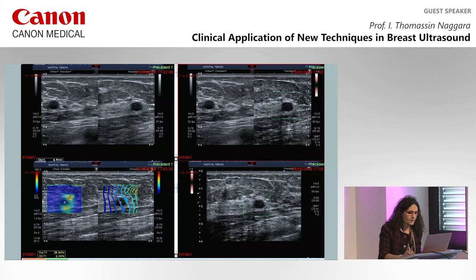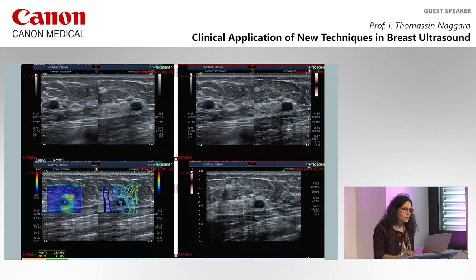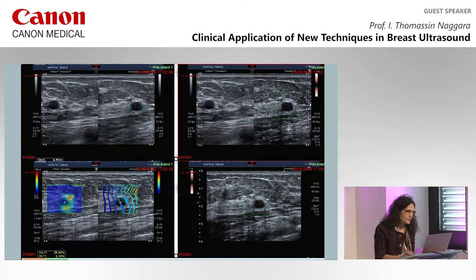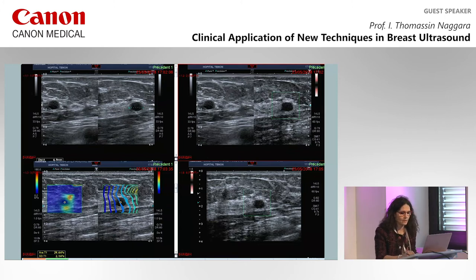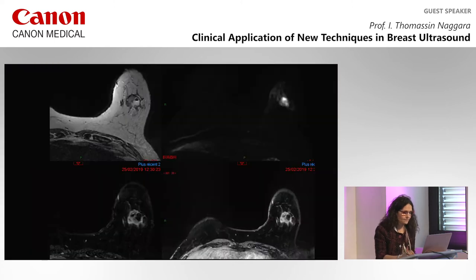Here is another example: a lesion that could be a complex cyst or a solid lesion. The elastography is reassuring — no deformability — and there is no flow on SMI. This lesion was a complex cyst.